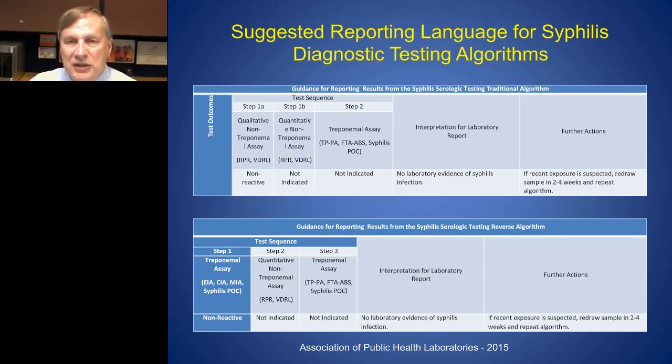And in addition, some of the rare situations will be covered, such as when we get an older individual with hearing loss and an audiologist wants to send in a sample to see if it might be related to a past syphilis case, where he or she might ask us to do just a treponemal assay. Some of the strange requests that we might occasionally get to support specific requests from clinicians and public health needs.